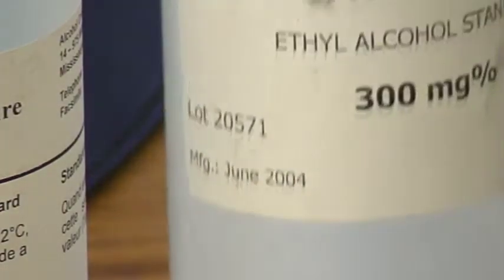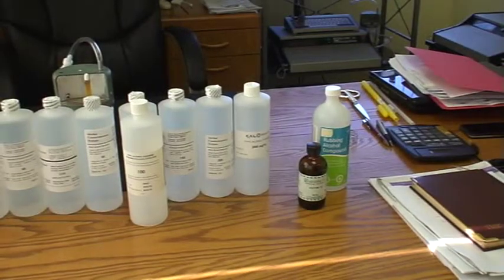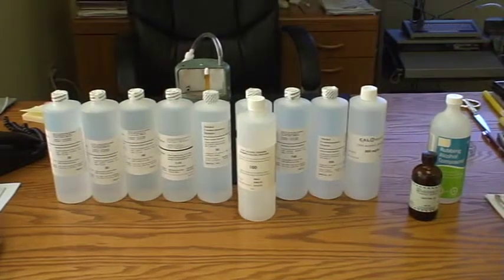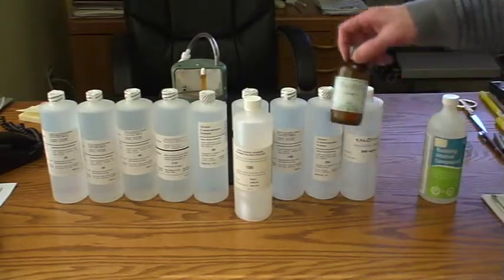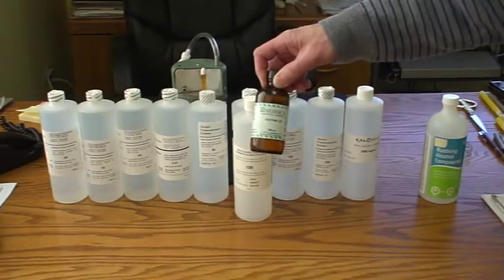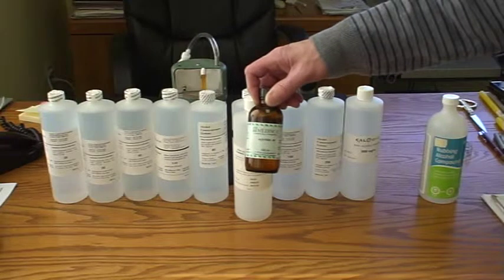Now, this doesn't say anything about temperature on it, but I wouldn't want to use it at any temperature other than 34.0 degrees Celsius. Now, just because you have an ethanol simulator doesn't mean you can't have a simulator that has something else in it. You could, for example, from a lab, buy a solution of a known concentration of acetone. In my particular case, I just bought acetone from a pharmacy, and I can mix some up myself. The problem is, of course, I don't know exactly what its concentration is. And I use this in very, very tiny amounts for testing with the instrument.